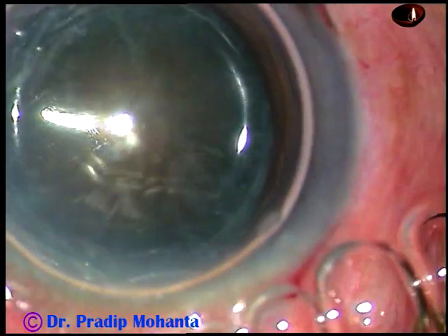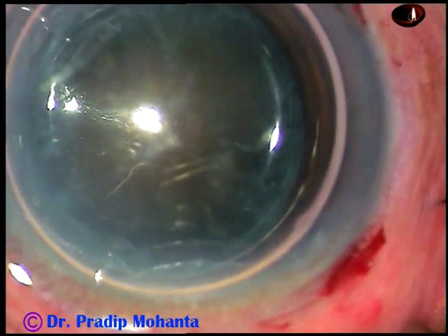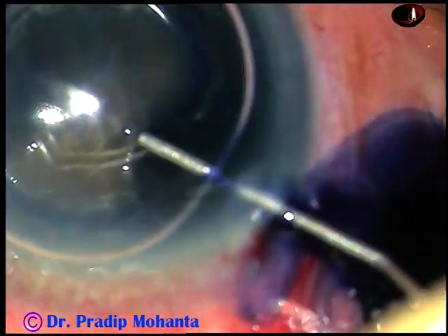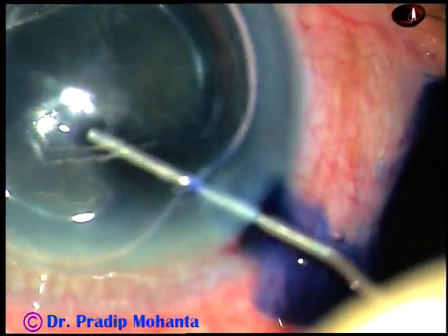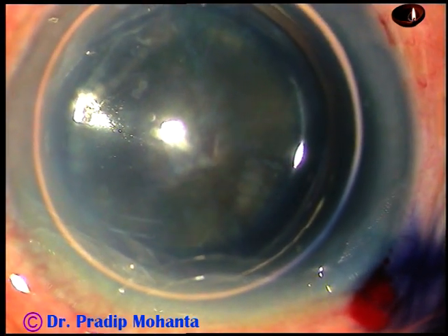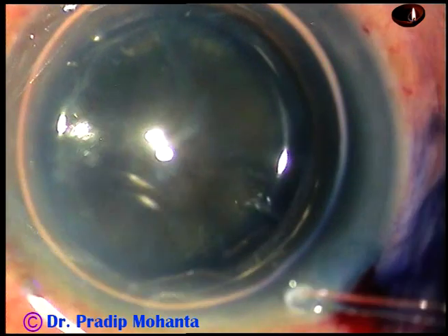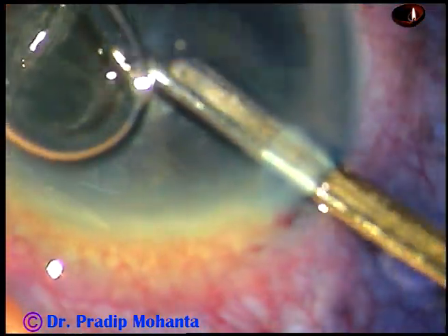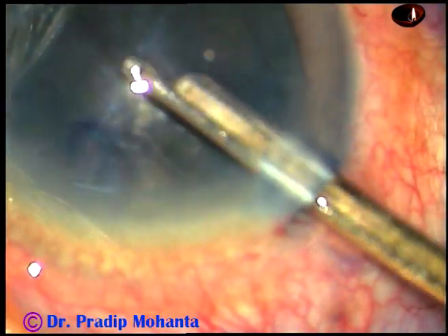Now an air bubble has been injected into the anterior chamber. This is trypan blue 0.06% dye, and now the dye is washed out with BSS balanced salt solution.